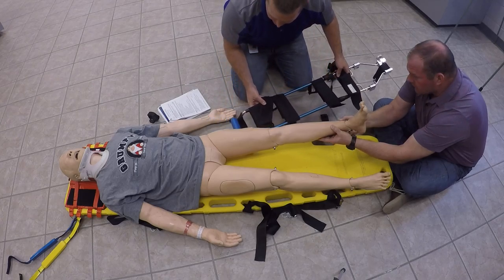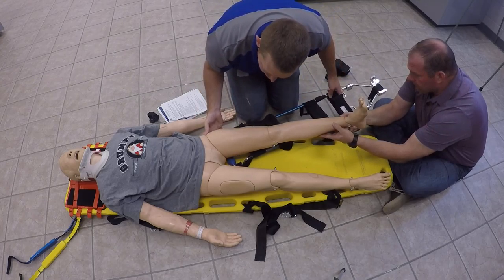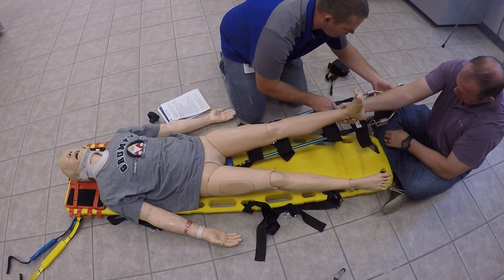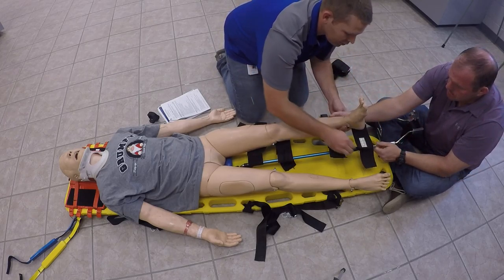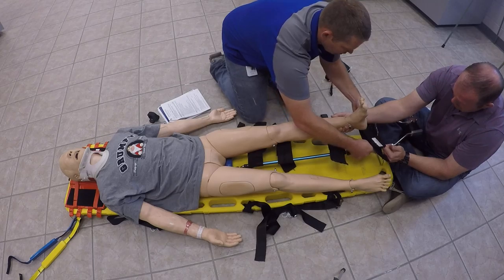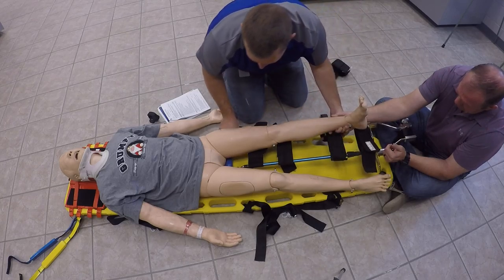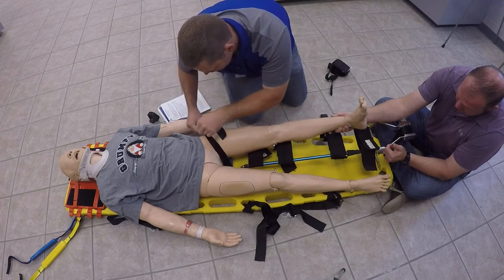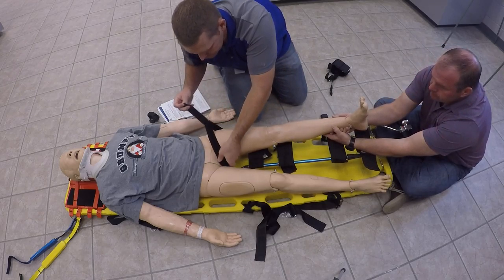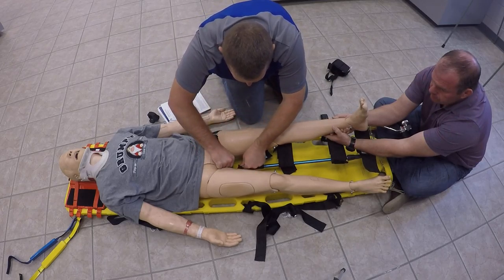Since he's already pulled traction, he's got the injured extremity elevated. We're going to go ahead and slide this underneath and position it. You're going to slide it as far up into the hip as you can. The first thing we're going to do is attach the ischial strap up here — that'll be our first one to attach — and go ahead and secure that in place. We want to make sure that it is very tight and that we get a good hold on that to keep the traction splint from moving at all.